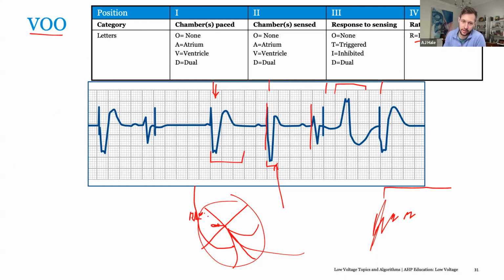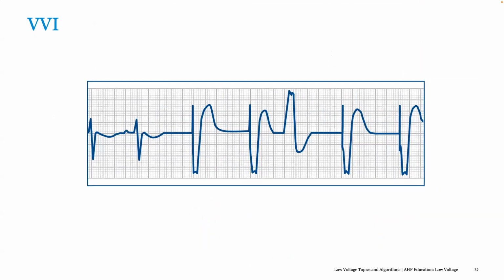Everything makes sense there? Pretty straightforward. Yes. Cool. Yes, it does. But I have a question. Can I ask? Yes, sir. All right. So, regarding the lower rates, perhaps for surgery, you change to VOO.